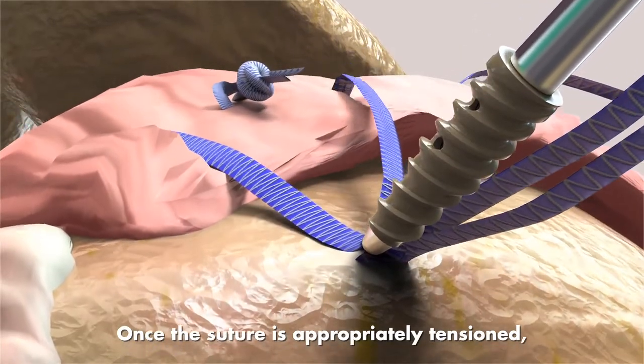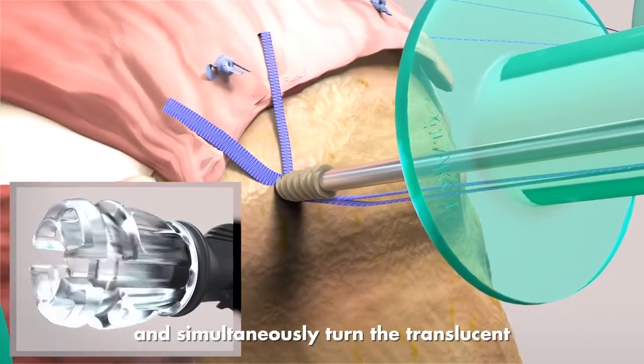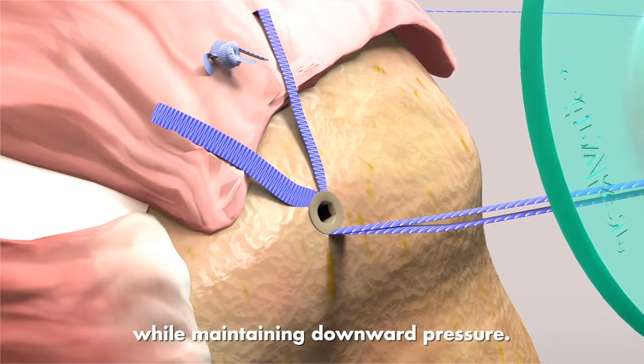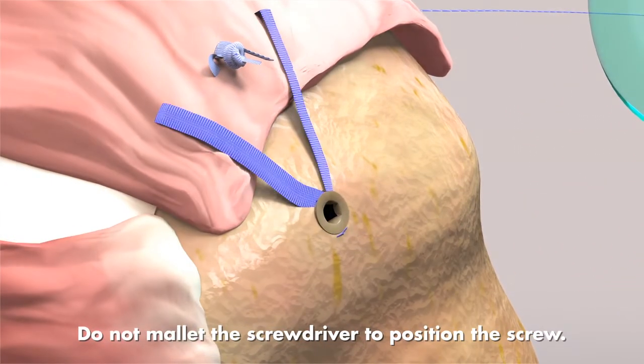Once the suture is appropriately tensioned, hold the black handle of the screwdriver and simultaneously turn the translucent proximal knob in the clockwise direction while maintaining downward pressure. Do not mallet the screwdriver to position the screw.